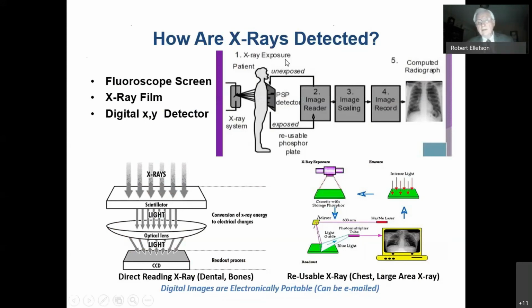If you have a larger chest X-ray that you want to take, there are devices that have a storage phosphor that can be placed here.